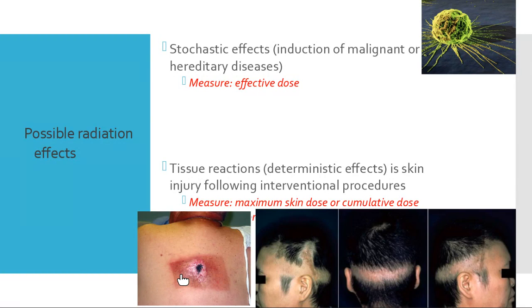Nowadays, unfortunately, many people, especially medical doctors, believe that if scan time is very short, that means the dose is less. No. You know that we have a proportional relation between time and tube current. Tube current means the number of photons. If I reduce the time, I increase the current. So the amount of X-rays is very huge, and in that case, we have to control radiation very, very carefully nowadays.